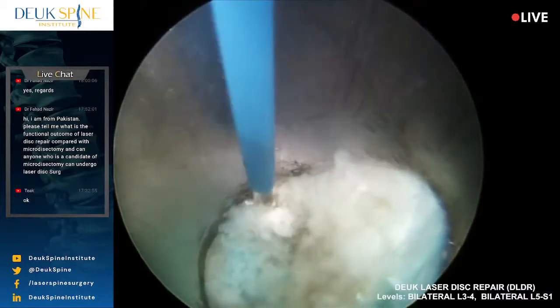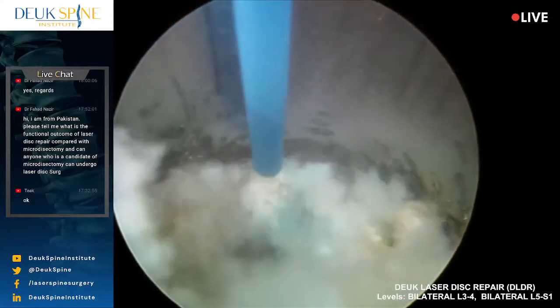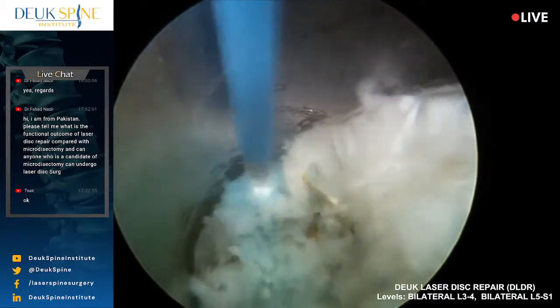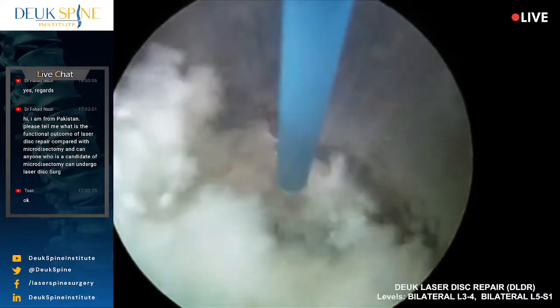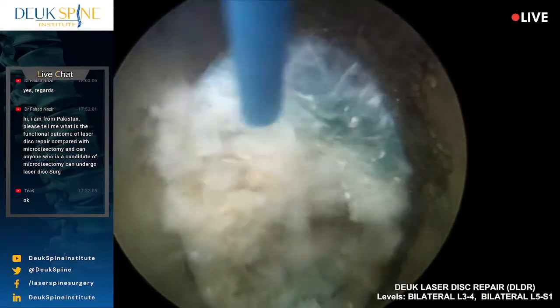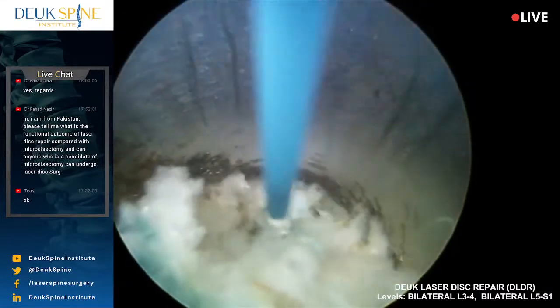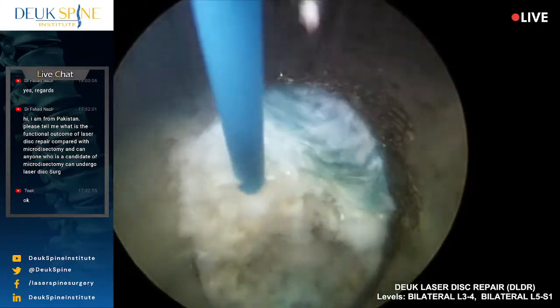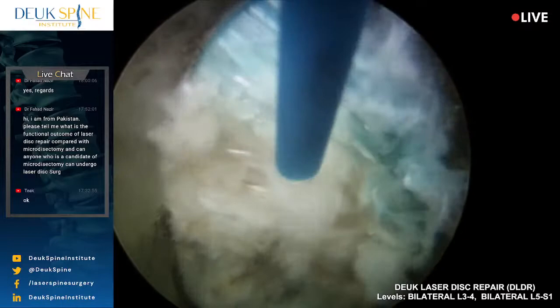All right, five more minutes on this disc, then we finish with the last disc. This is all scar tissue.